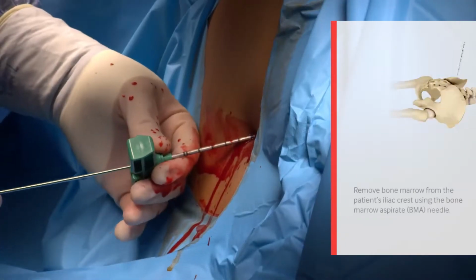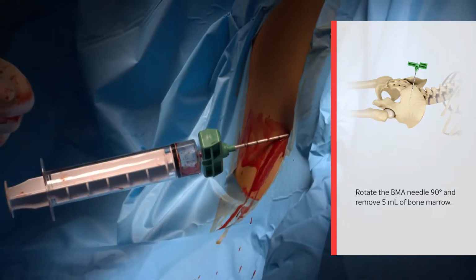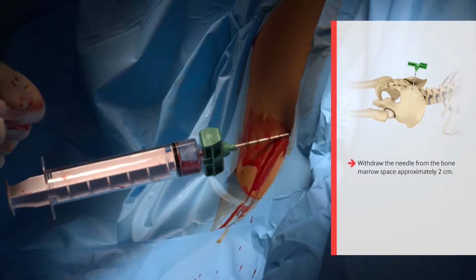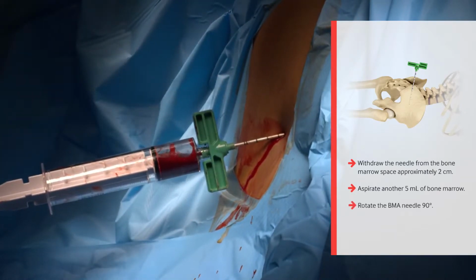Remove bone marrow from the patient's iliac crest using the bone marrow aspirate needle. Rotate the BMA needle 90 degrees and remove 5 milliliters of bone marrow. Withdraw the needle from the bone marrow space approximately 2 centimeters. Aspirate another 5 milliliters of bone marrow. Rotate the BMA needle 90 degrees.